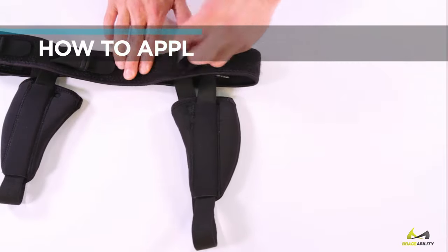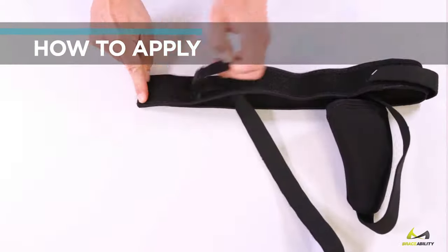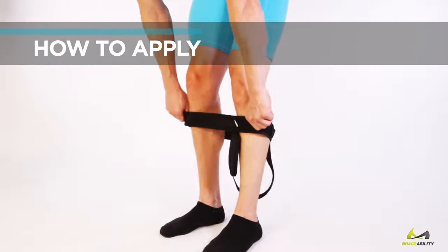To apply, start with straps fully loosened. For a single hernia, remove the extra pad pocket. Step into the brace like underwear or pants.